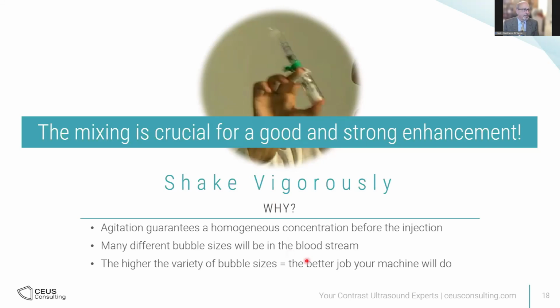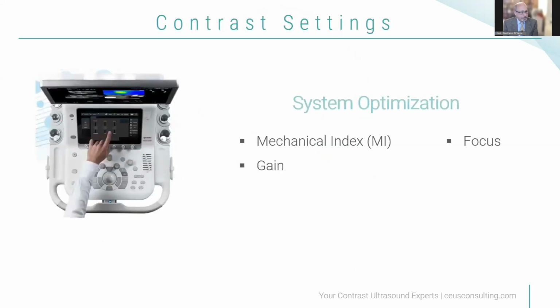So the agitation guarantees a homogeneous concentration. As I said before, there are many different bubble sizes, and you need them all. And the higher the variety of bubbles, the better the enhancement will be.